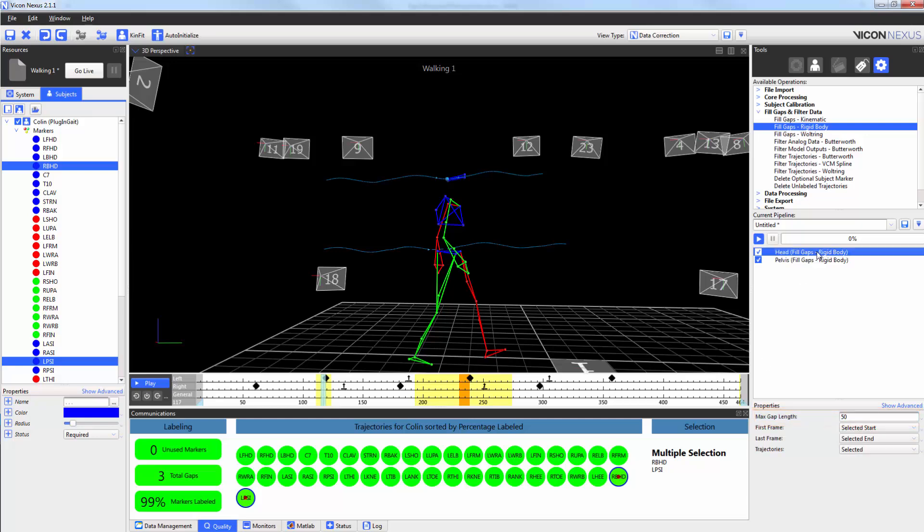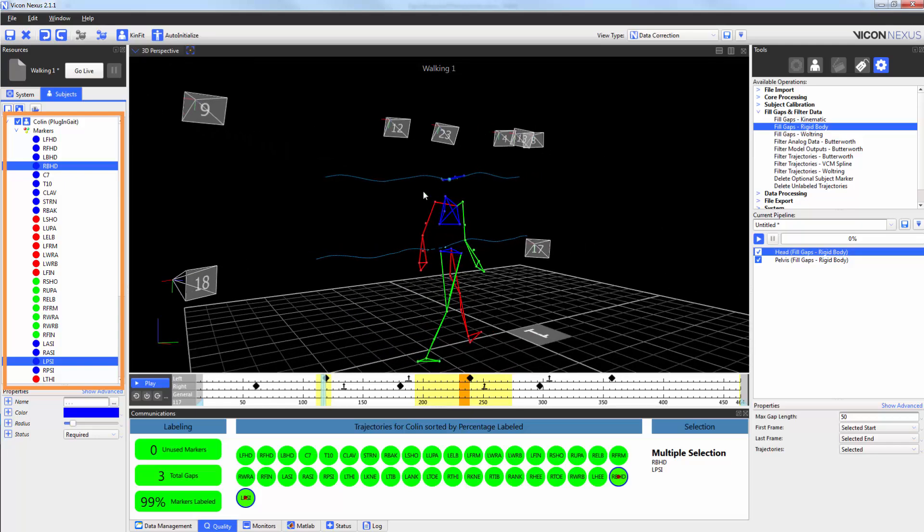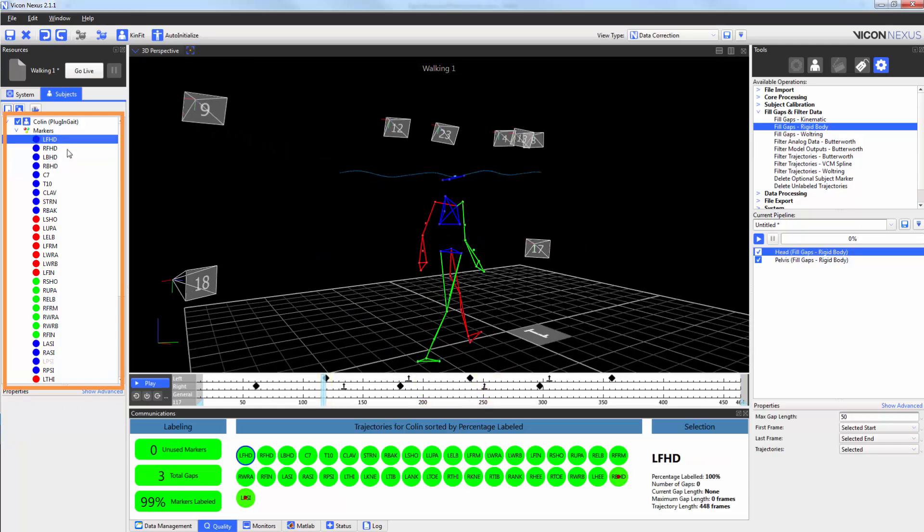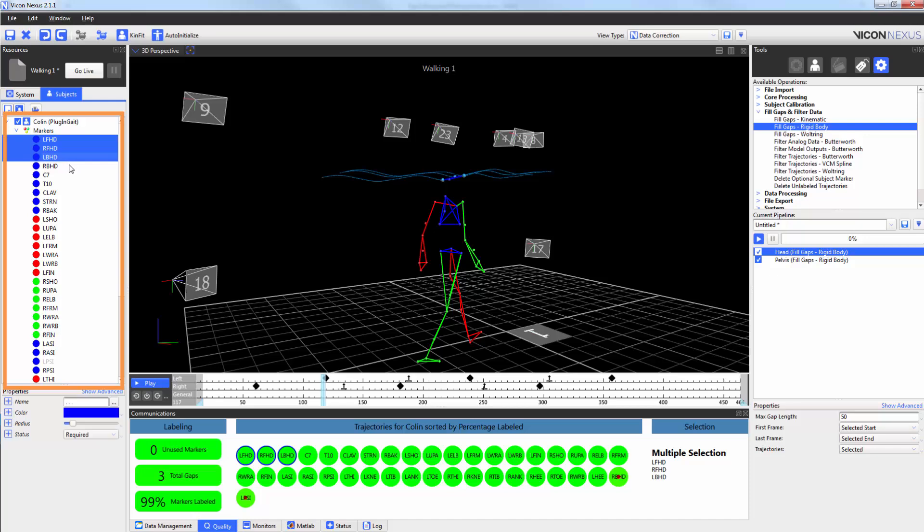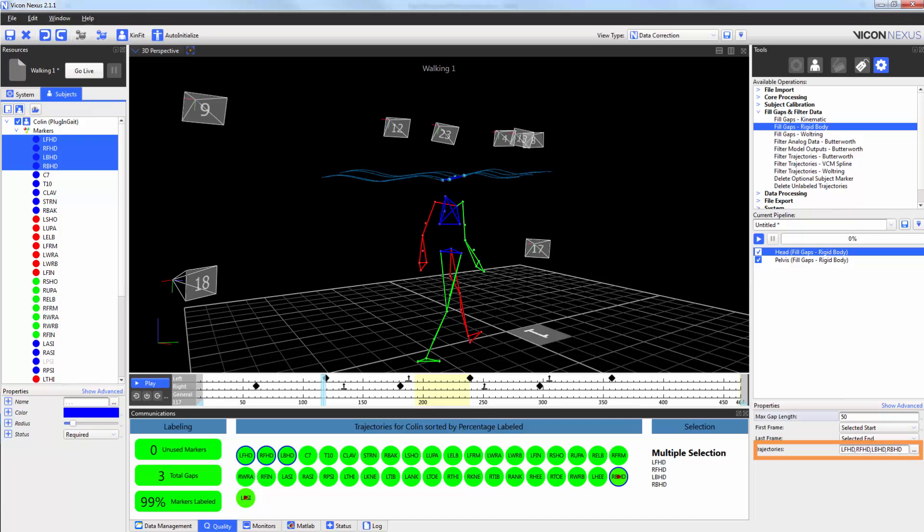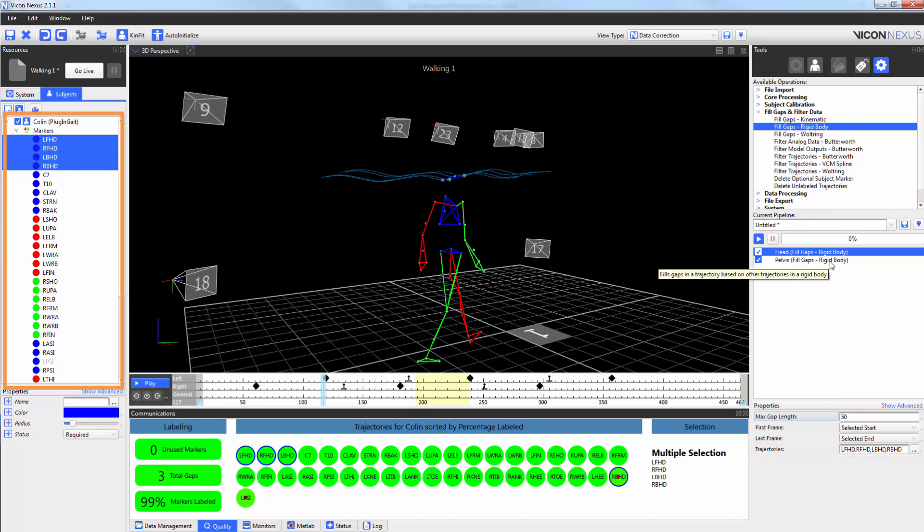Now I'm going to select the trajectories to use to recreate the missing gaps. In this case here, I'm going to use the markers on the head from my gap filling list. I'm going to turn the macro off so that the list populates down here. I'm also going to do the same for the pelvis.